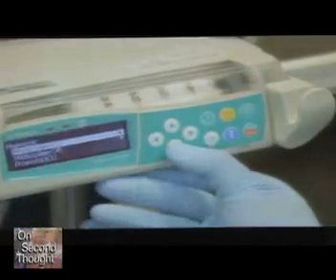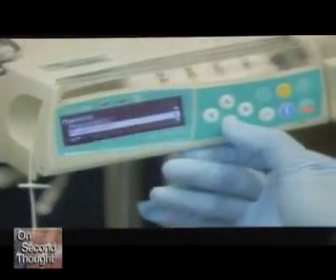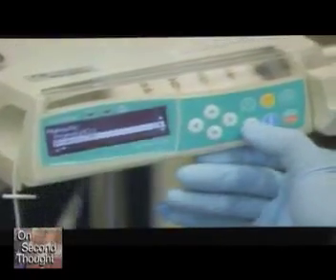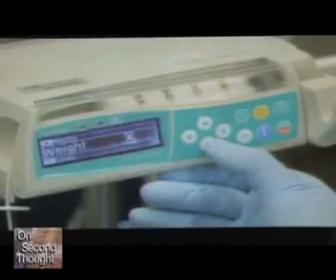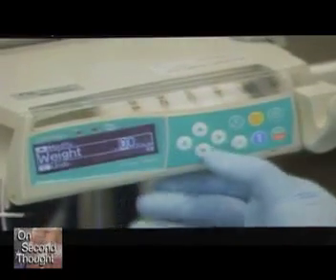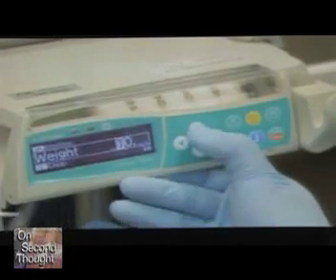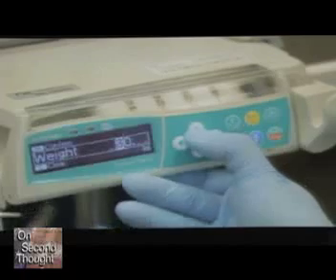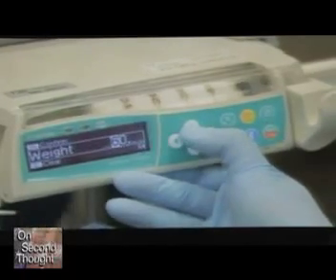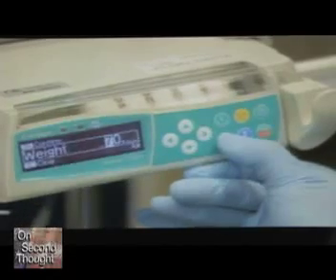Midazolam is the first choice, but that's not what he's going to use. He moves down instead to what is called propofol OR, OR meaning operating room. So this is the propofol operating room. He now enters the weight of the patient. So this is done through this keyboard. Again, this takes time and care to do this correctly. He's entered the patient being 70 kilograms.